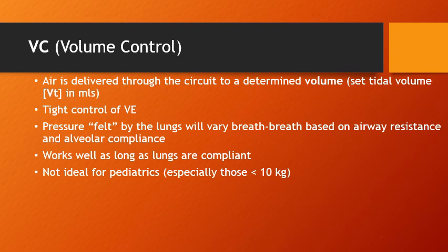The pressure the lungs feel every breath is going to be different just based on that airway resistance and alveolar compliance. If the lungs can't stretch well, if they're very non-compliant, if the airway has a lot of resistance in it due to bronchoconstriction or secretions or inflammation, then all that tidal volume that you're blowing in is going to create really high pressures because no matter what, it's going in.